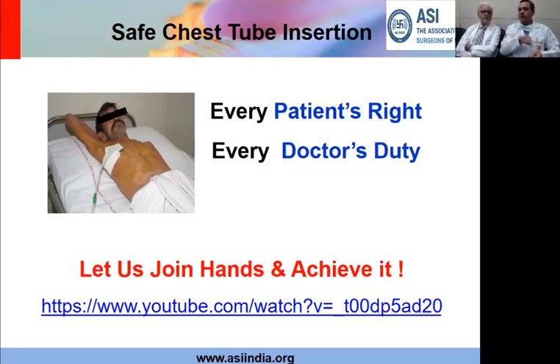Two things I have against putting the finger. One is, it will necessarily need a hole bigger than the chest tube. And two, I have found this to be extremely painful. No matter how much local you give, when you put the finger and do this maneuver, it causes more pain. When you have pneumothorax and lung collapse, or hydrothorax or hemothorax and lung collapse, the lung is actually away from your chest wall, so the possibility of your tube injuring the lung is remote.